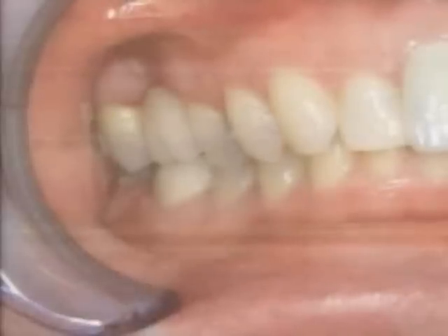And again, nothing in the roof of your mouth, no other appliances. It stays in there. You brush it. You can floss in between the teeth. You don't have to grind down the natural teeth on either side as you normally do for a bridge, a fixed bridge or crowns. We don't grind the teeth down. So we're preserving the healthy enamel of the other teeth, and we're just simply replacing the tooth that's missing.